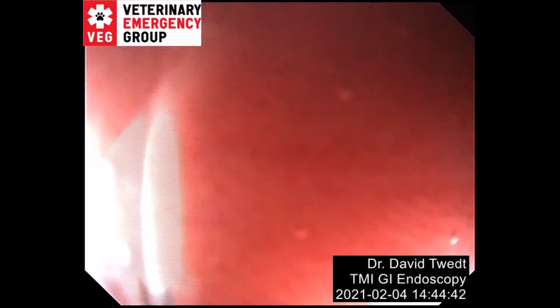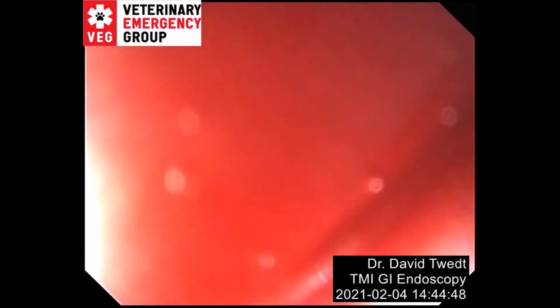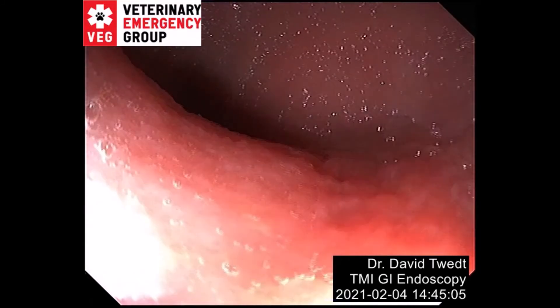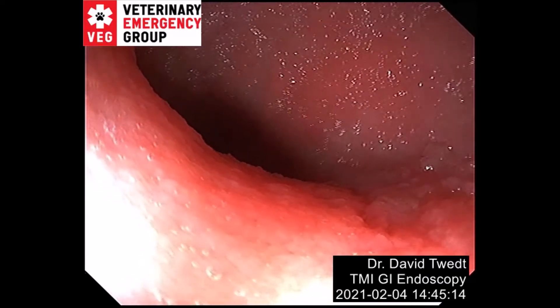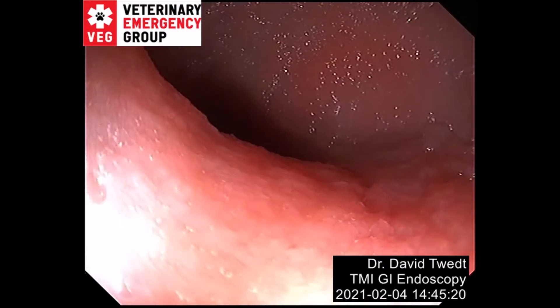When you first go through, the duodenum takes a hard right-hand turn, so you'll go through and into a wall. Remember it's a right-hand turn, so in your mind's eye you say: I need to start moving to the right to open up the duodenum. Because I know my anatomy and I recognize the duodenum tissue — boom. The whole first section of the duodenum is basically missed on the way in; we'll take a closer look on the way out.